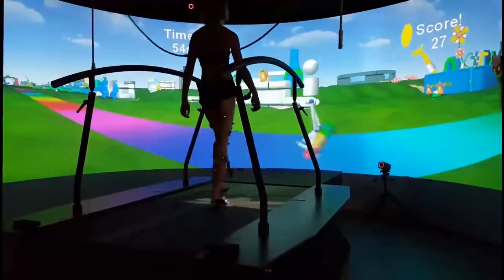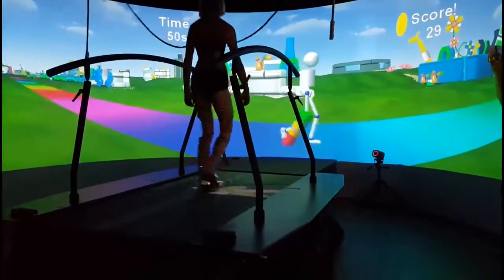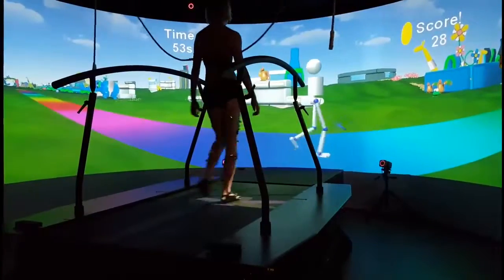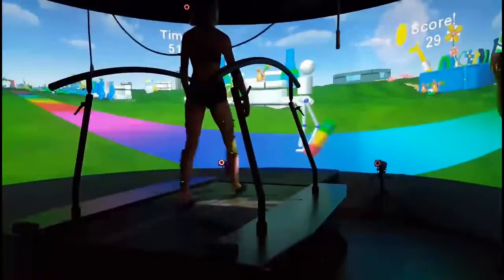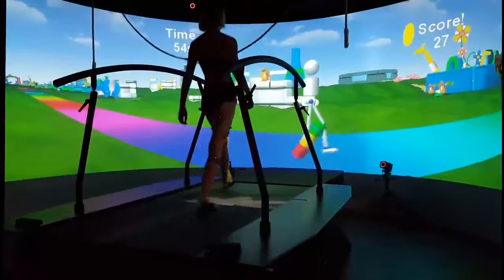When it's in the red, you're not pushing hard enough. And so this gives people some encouragement to do well. And each time you do well, you score a point. So you can turn this into a game and make the training very effective. Go back to my screen here.